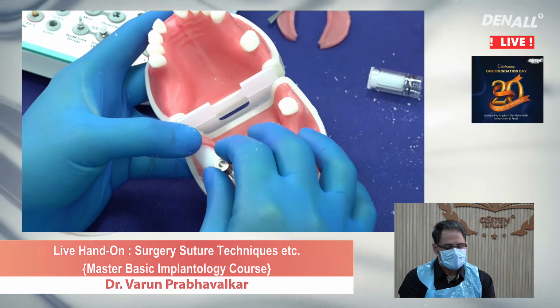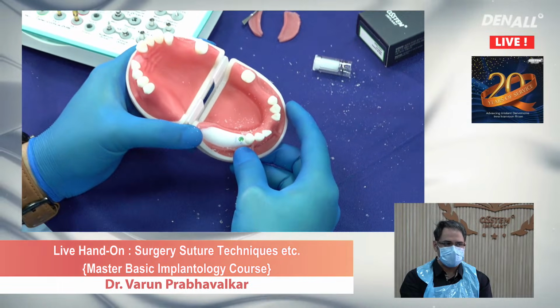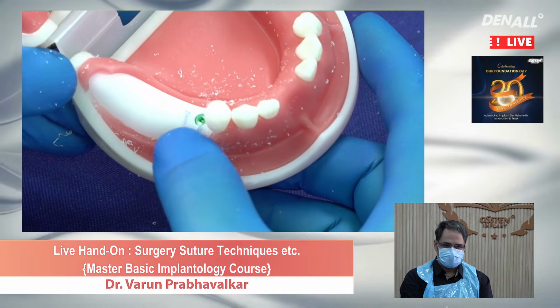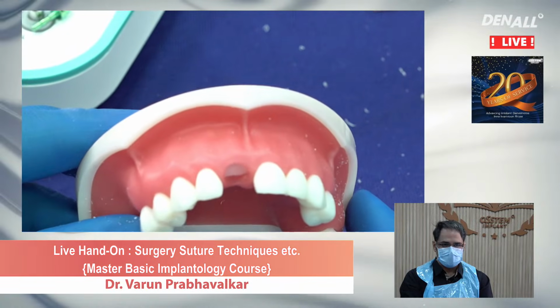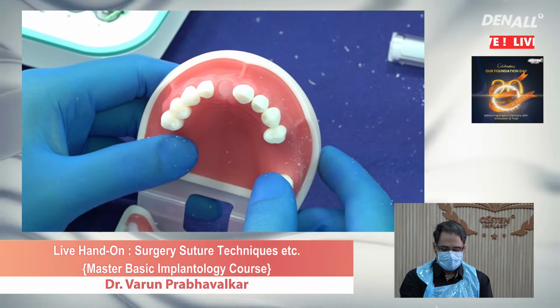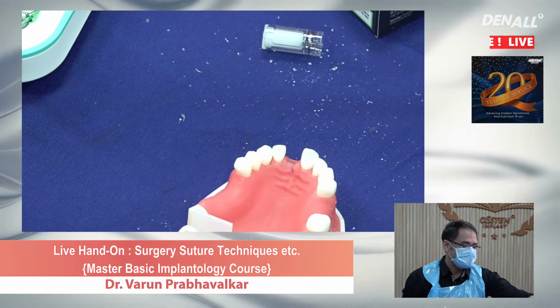Okay, so that was about how to place an implant in a category A pristine bone. Okay, our next exercise would be placing an immediate implant at the site 11 or 1-1. Okay, let's observe the socket for a bit.